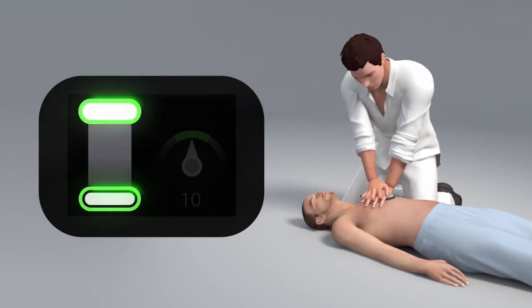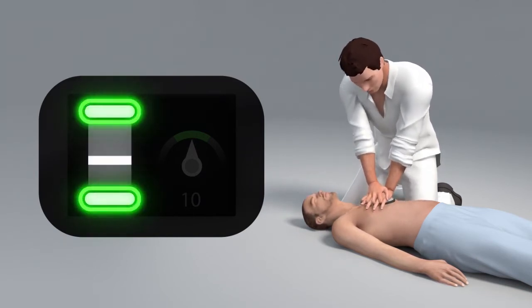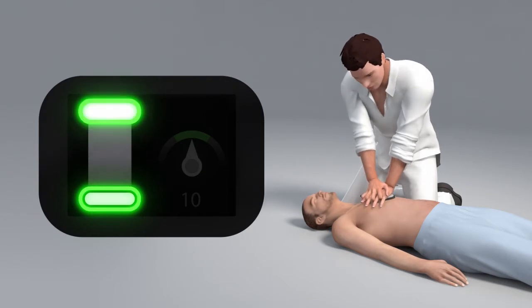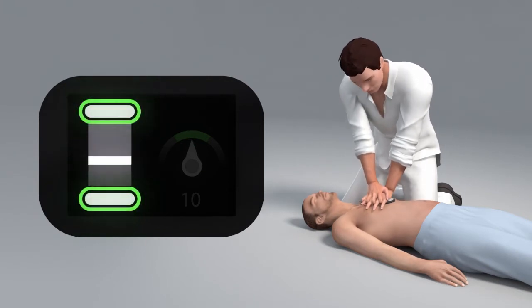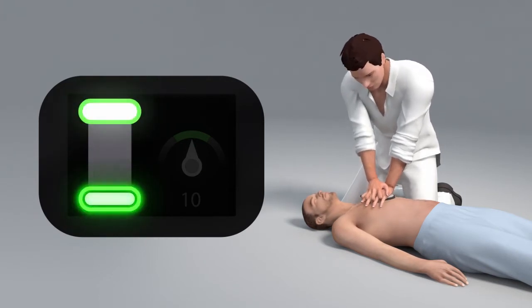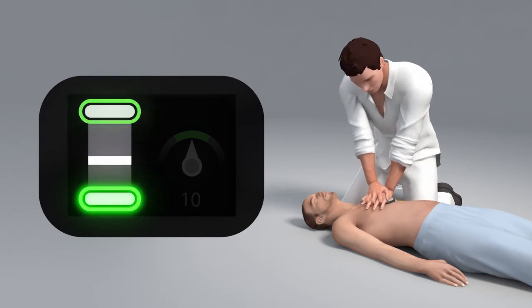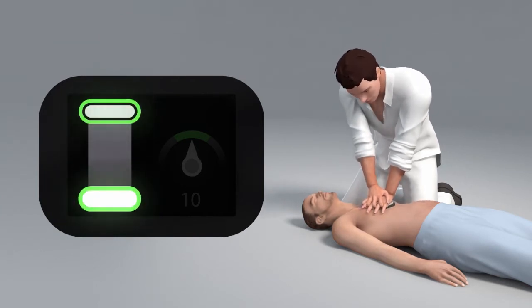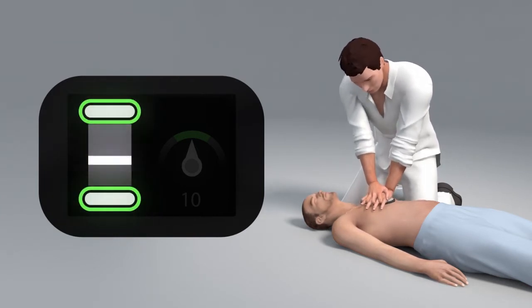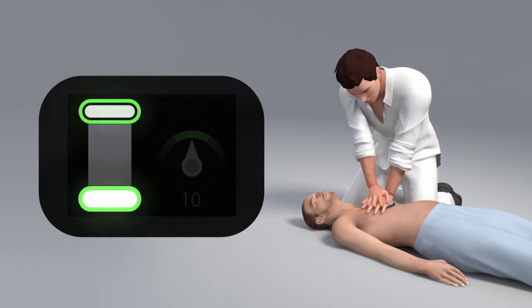The green circled areas are called target areas. The lower target area represents the depth target. This area lights up when you are compressing deep enough.